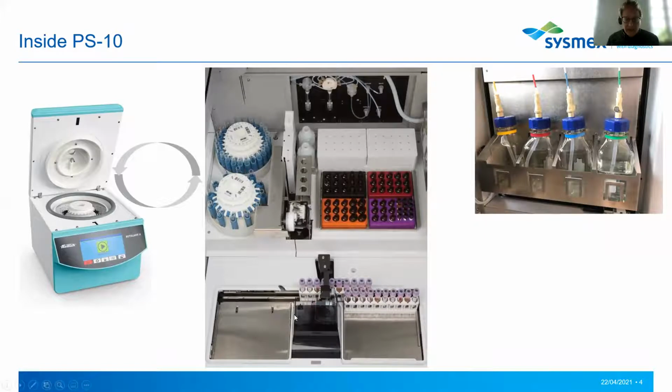And in the lower part, you see here space for blood tubes, blood sample tubes. You can load up to 50 tubes at one time. And in case you encounter sometimes a tube which does not fit here, so they can fit several, we've got these 4 open positions where you can also place other tube types that you might want to analyze or use the PS10 for.